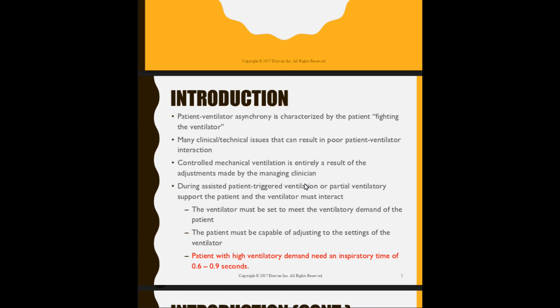Okay, also too, when you're doing your vent checks, that's another time to do a visual assessment. You want to make sure that the patient is not within or below their means to ventilate. Okay, so we want to make sure that the ventilatory demands are met. Okay, also too, that when we're there and doing the vent checks, we're able to adjust the settings if necessary.